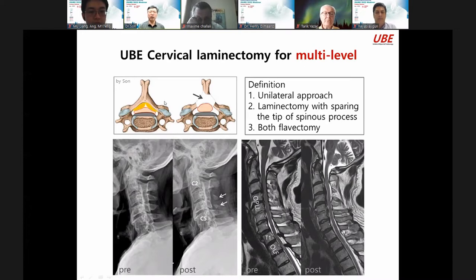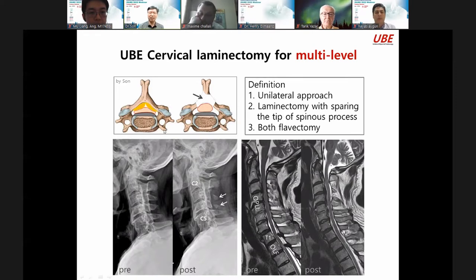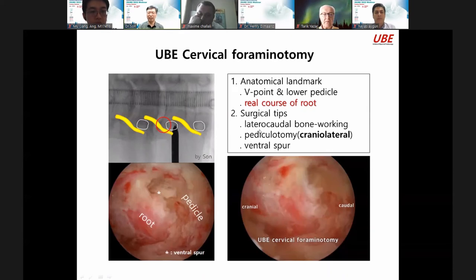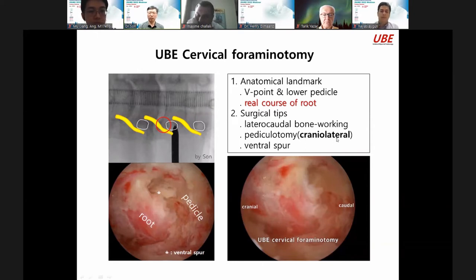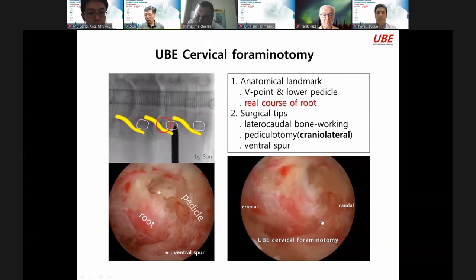This UBE is cervical foraminotomy. The anatomy landmark is the V-point — the low pedicle is important. The real course of the root is important. I always emphasize the craniolateral border of the lower pedicle. Pediculotomy is important. After removing the upper border of the hemi-laminotomy and the bone spur, decompression is achieved.